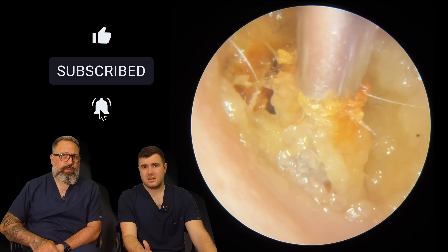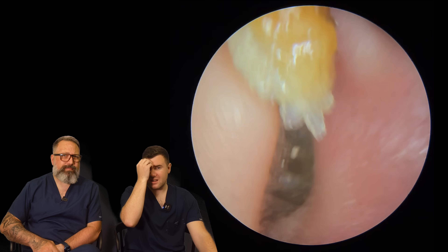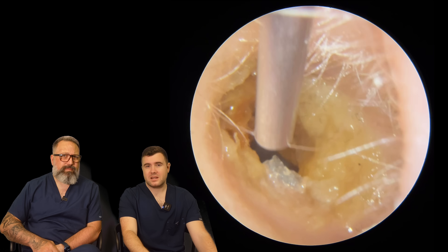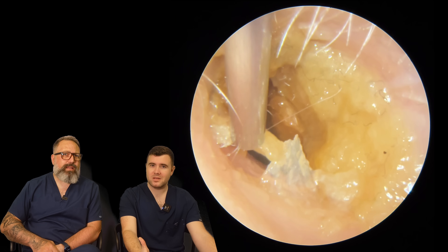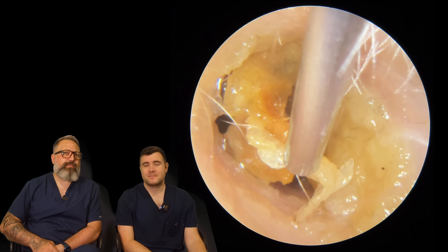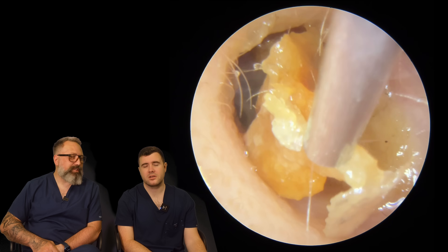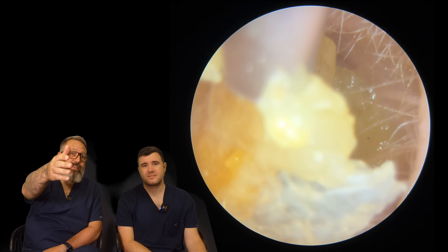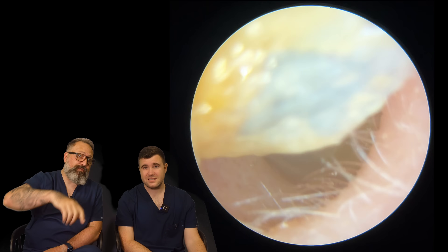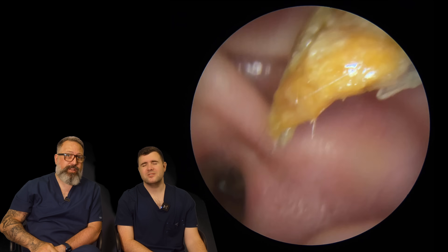And you can see this is just kind of holding on, these little tiny bits on the edges. It's like Marmite, these removals with the skin — it's like you either love doing them or you absolutely hate it. I think if it's well-behaved skin, they're lovely ones to do. But when you've got these lots of lifts, it doesn't really peel away very well. Like this — look at that. That is coming away fabulously well. I like that one. We love to see it.